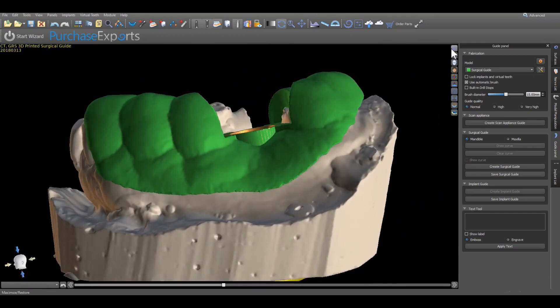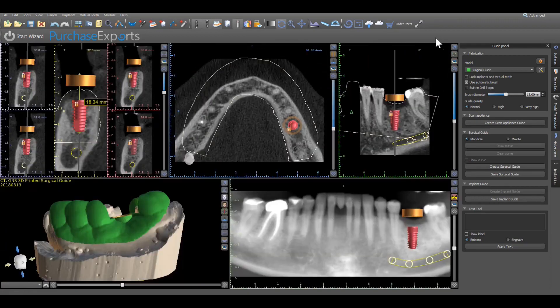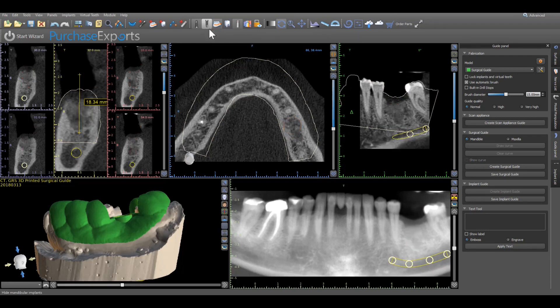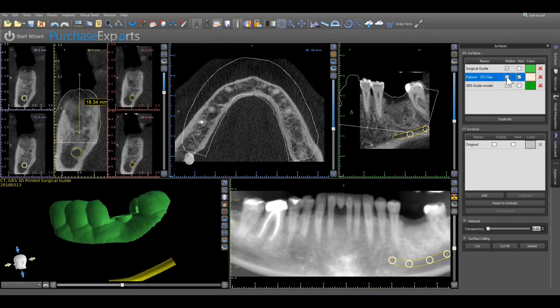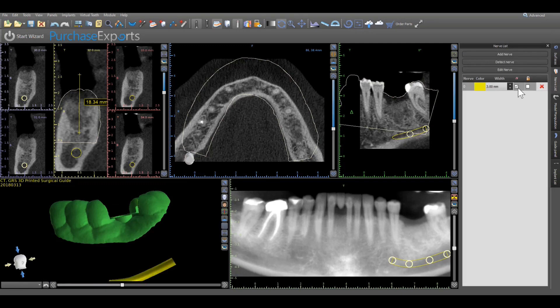It is also suggested to view the surgical guide in its native state by removing the model and guide tube elements from the 3D screen. This is easily accomplished by clicking on the implant icon at the top of the screen to remove the visibility of all implants and guide tubes. Then highlight the surfaces menu and turn off the visibility of the original model, along with any rendered nerves, by clicking on the nerve list button and turning off nerve visibility.